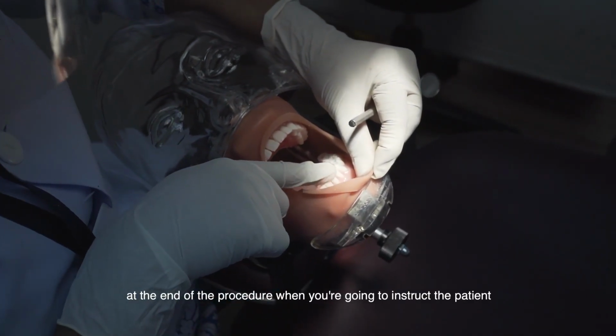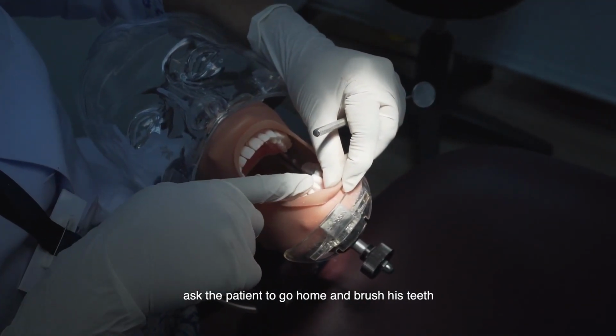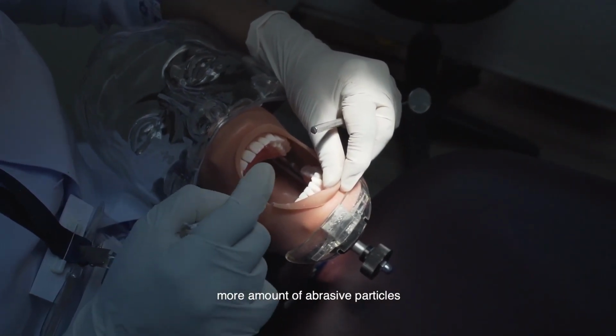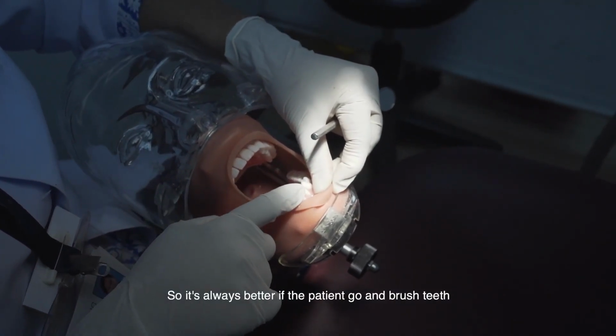At the end of the procedure, when you instruct the patient with oral hygiene instructions, ask the patient to go home and brush his teeth, because this polishing paste contains a large amount of abrasive particles which tend to seep inside the gingival crevicular area. So it's always better that the patient goes and brushes.